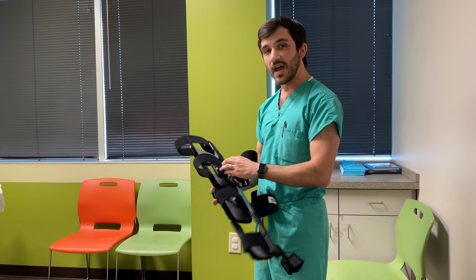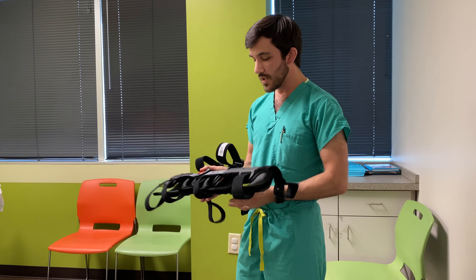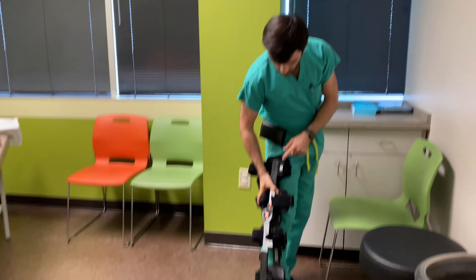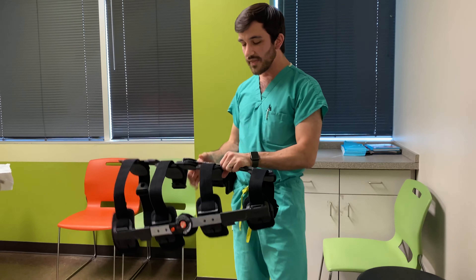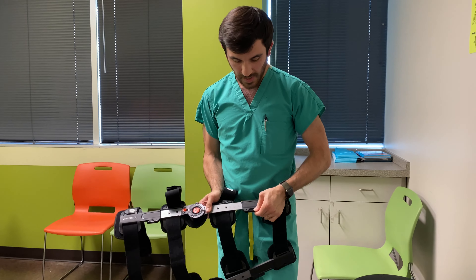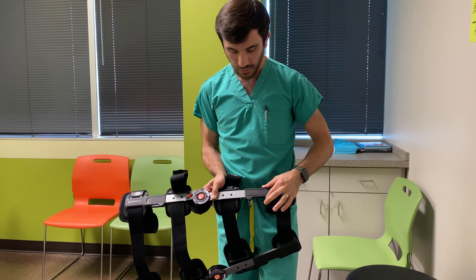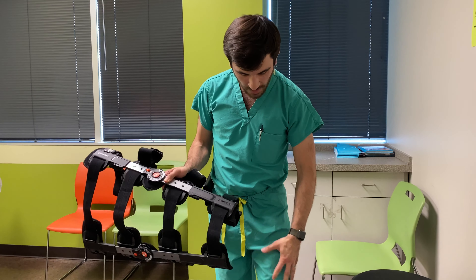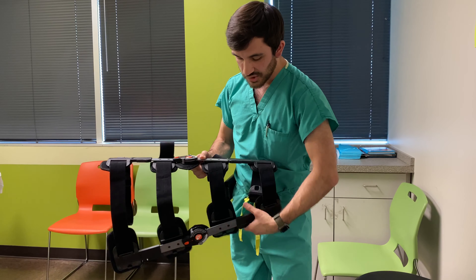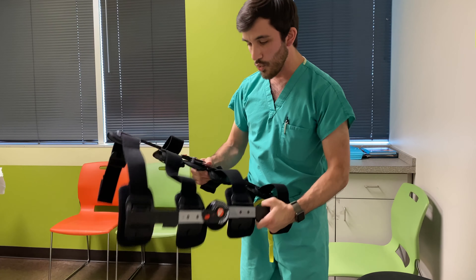Once you've got the orientation figured out, you need to decide how long it needs to be. We aim for middle of the thigh to just above the ankle. That can be achieved by telescoping the edge of the brace. You can see there are markers to help keep it consistent. They may be different on the top and lower portions, but make sure that on each side it's at the same point.